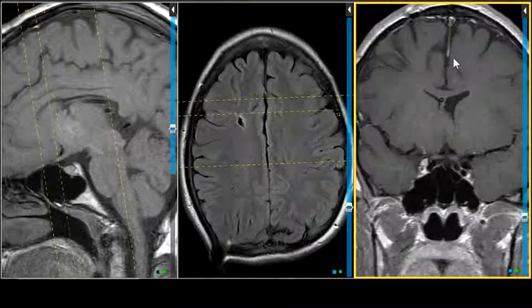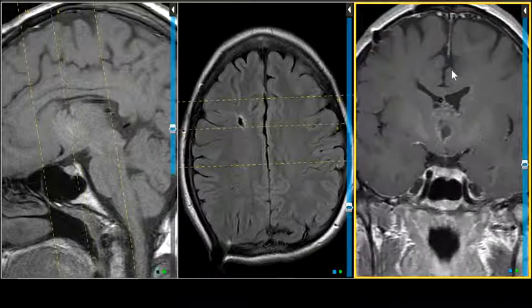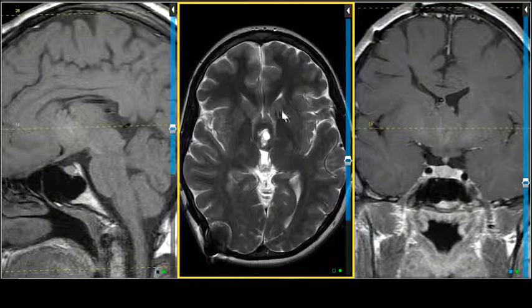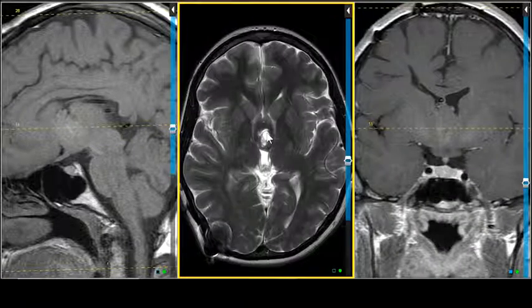Two quick points. In the coronal projection, it's rather surprising. It's actually not that surprising. It's mildly surprising that this papillary craniopharyngioma has very scant, little enhancement on contrast-enhanced coronal MRI. You see the nice tapering, by the way, of the pituitary stalk, a little chubbier at the top, thin at the bottom. And then in the axial projection, you can see the lesion is pretty solid, as most papillary craniopharyngiomas are, in contrast to the adamantinomatous variety.